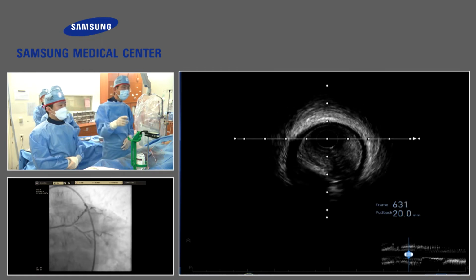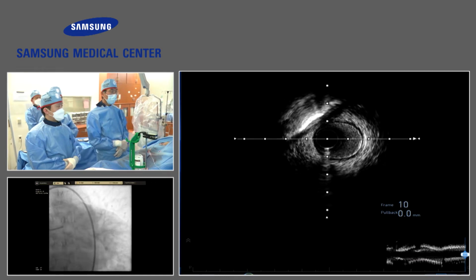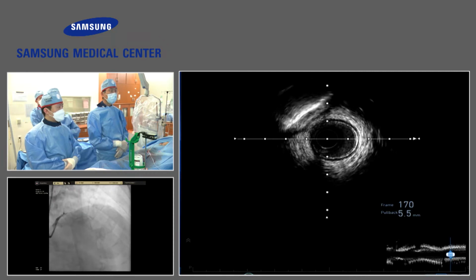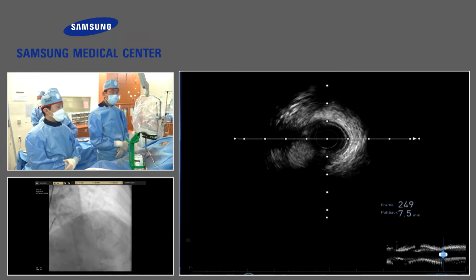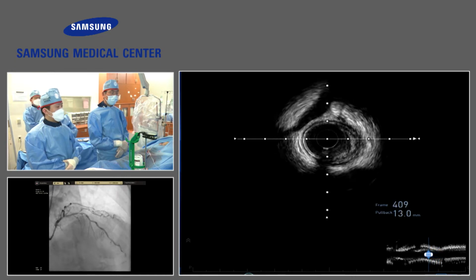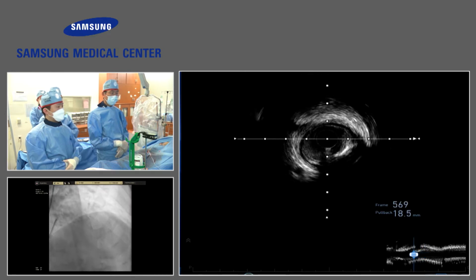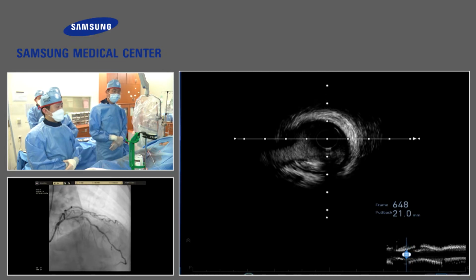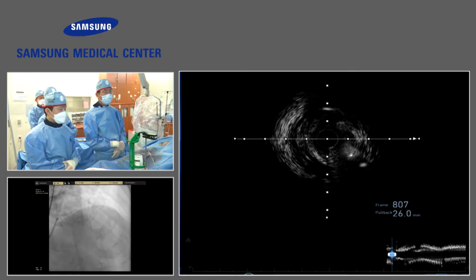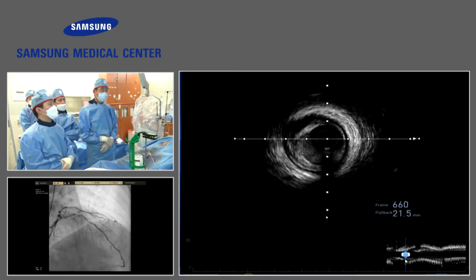And lastly, I'd like to show the IVUS from the diagonal. Diagonal distally branches to 2.0, normal looking. It's about 30% stenosis, vessel size 2.0, up to 3. It's approaching the ostium. Yes, very short, eccentric, about 70% stenosis there. So this is also very short.